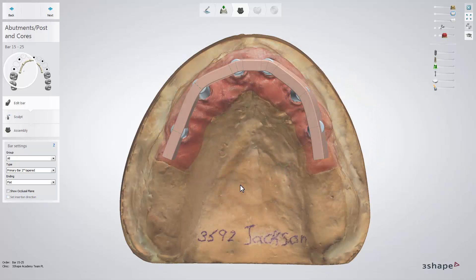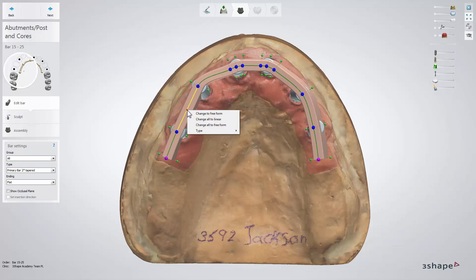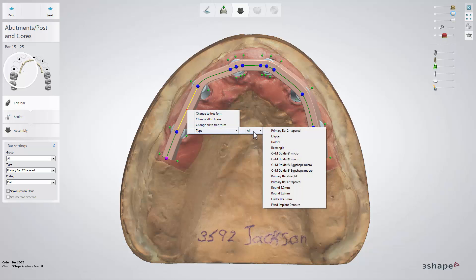The software allows you to change the bar type in a few ways. You can hover the mouse cursor over the bar and when a red control point appears, right-click it to switch from freeform to linear for a section between two control points or for the whole bar. It is also here that you can change the bar type for a specific section.